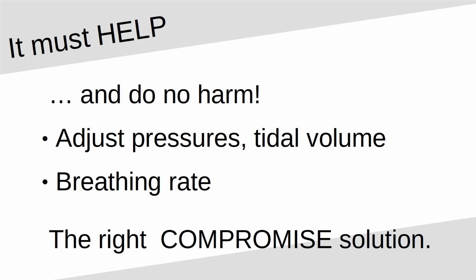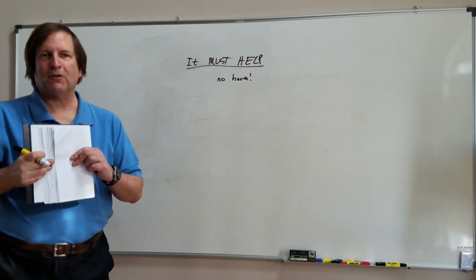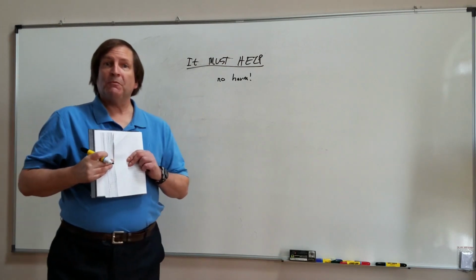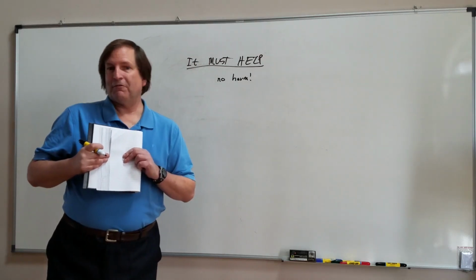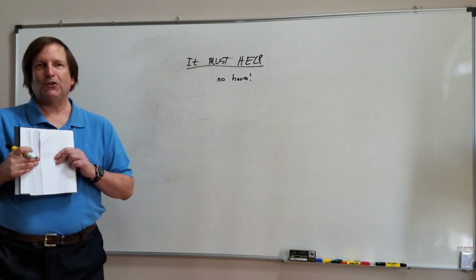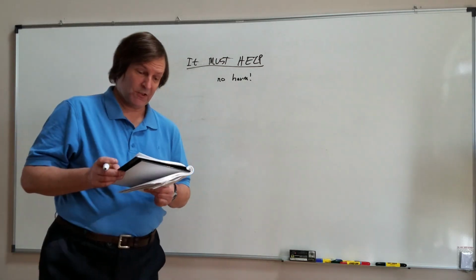point. A very critical one. And again, "do no harm." And that is critical for a number of reasons. The first thing is the human lung is in fact very susceptible to overpressure or barotrauma. Ask any scuba diver that. That's the first thing they teach scuba divers, the dangers of compressed air from your scuba tank in your lung and how to avoid it when you're ascending to the surface.